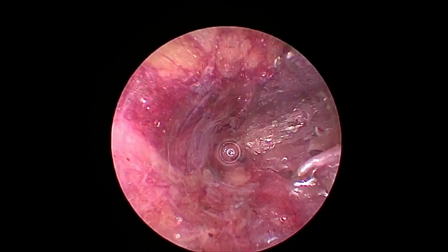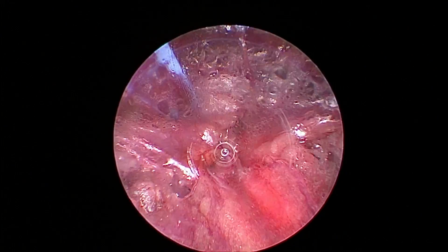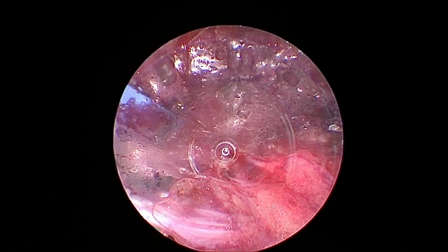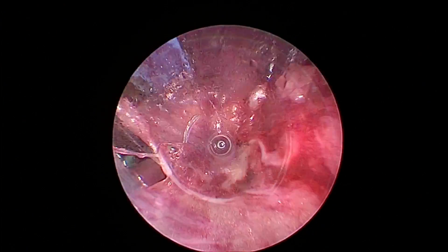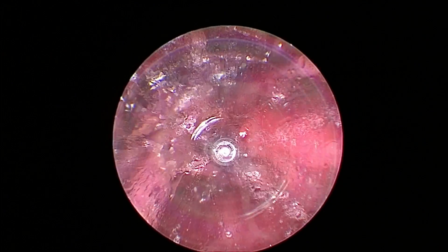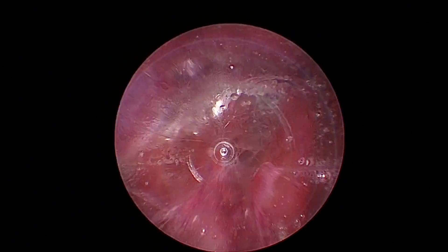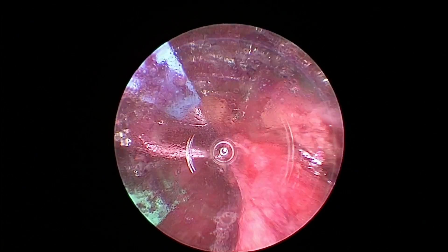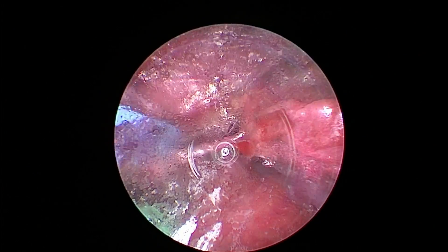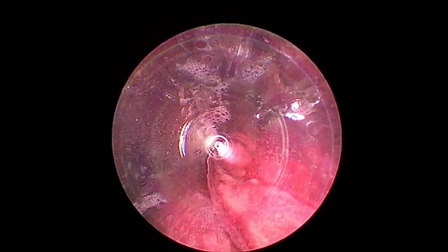I'm going to start to work lateral now that I don't have the fascia opened up above it. I work lateral — right and left — create a little window above the fascia, then take a little more fascia down. That's how I approach it. You can see there's very little thermal spread, just between those two blades. It's tailored to the size of the branch, so it delivers the energy that's needed.